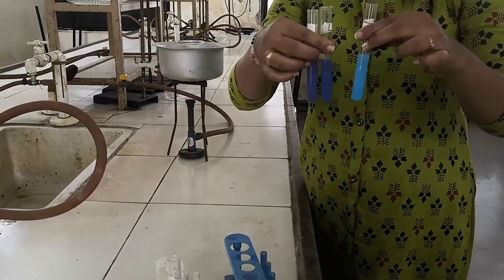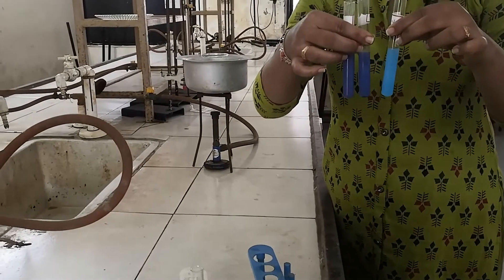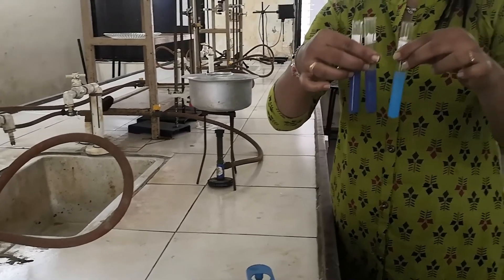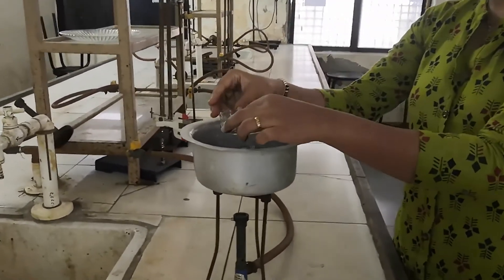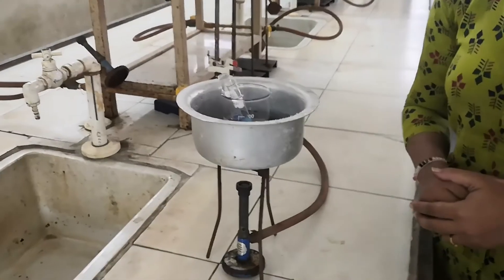After addition of all ingredients, this is how all three test tubes look — blank, standard, and test. Then place all three test tubes in a water bath and maintain the temperature at 37 degrees Celsius for 20 minutes.